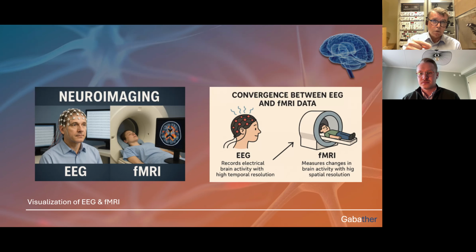Because at the end of the day, what you're trying to do is correlate an electrical effect in the brain with a certain pathology or certain behavior, or a certain effect of your drug. So it's quite a huge amount of data analysis, and that's actually done by experts. But yeah, the picture on the left is correct. Both EEG and fMRI at the same time.